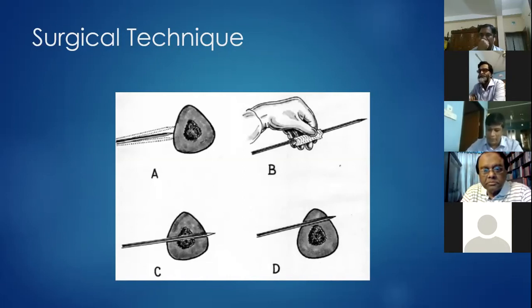Ideally, the wire is drilled through both sides of the cortex, passing through the bone canal and bone marrow. Transmedullary wire insertion rather than cortical insertion is important because it provides greater wire stability and helps prevent cortical osteomyelitis. When the second side of the cortex has been penetrated, drilling is terminated. At this moment, the surgeon must try to pull the wire backward slightly. If it is firm and unmovable, the wire is in the correct position. If it pulls back easily, the direction of the drilling must be changed.